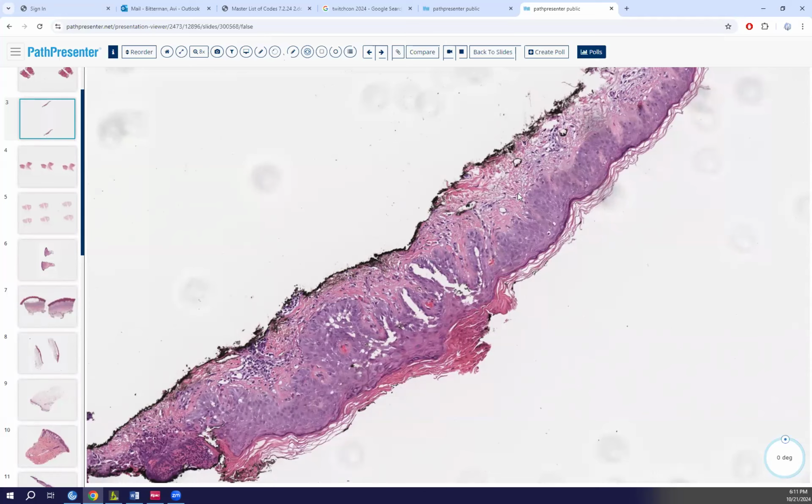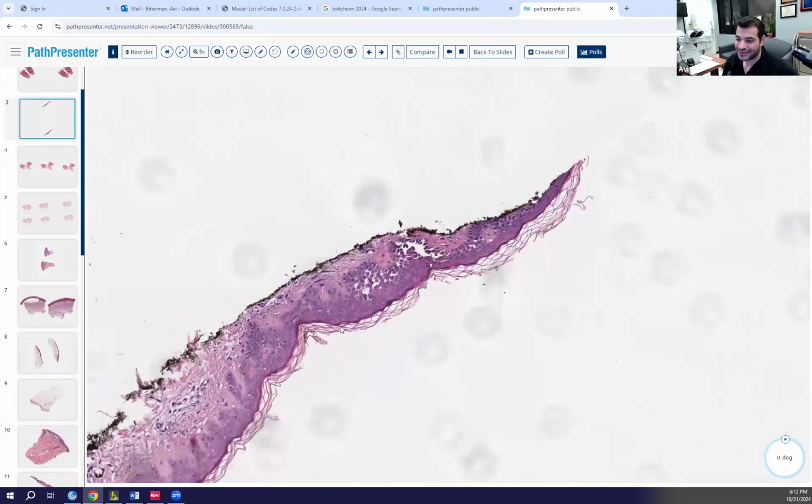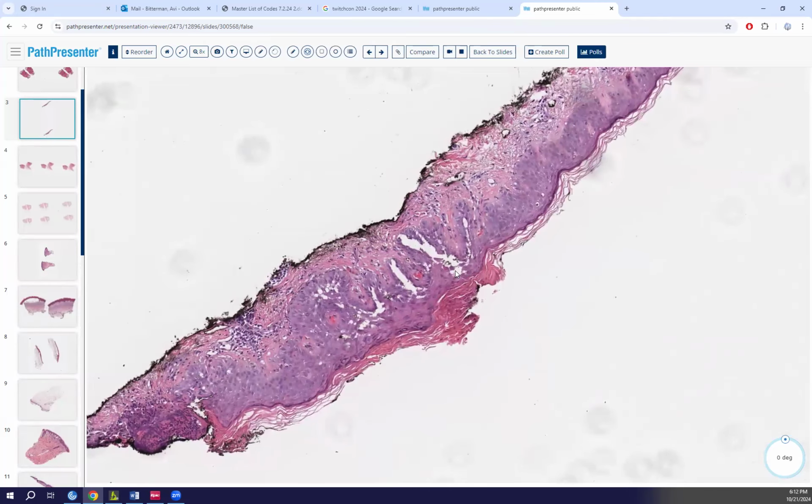They're not as similar, like pemphigus vulgaris and foliaceus and bullous impetigo and staph scalded skin, but they're not primary acantholytic dyskeratosis. Because you said there were corps ronds, I'm going to take out pemphigus, take out bullous impetigo, staph scalded skin, and then add Grover's.